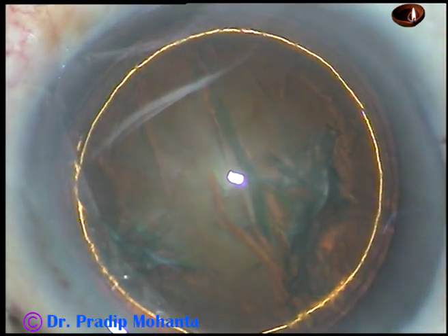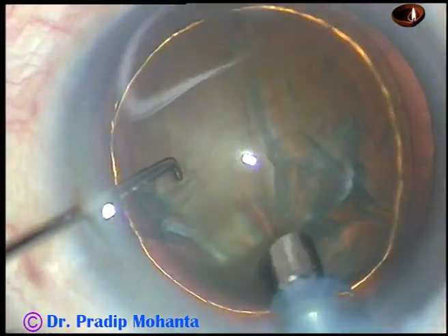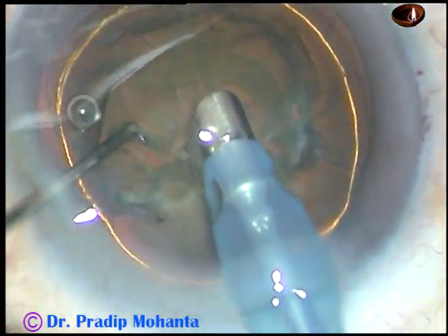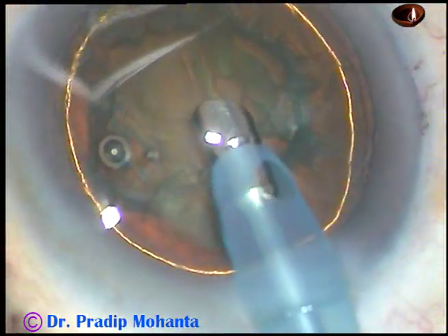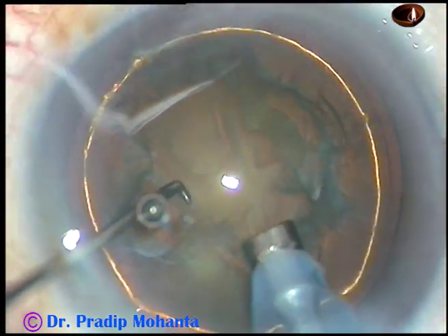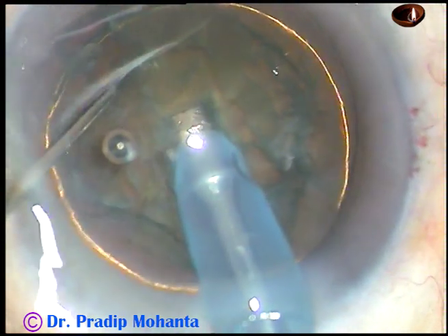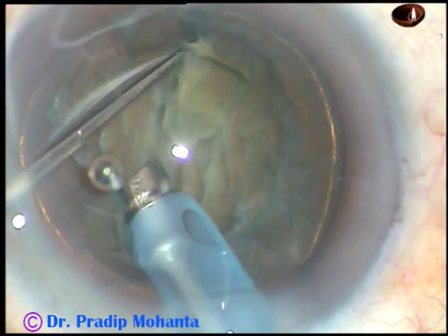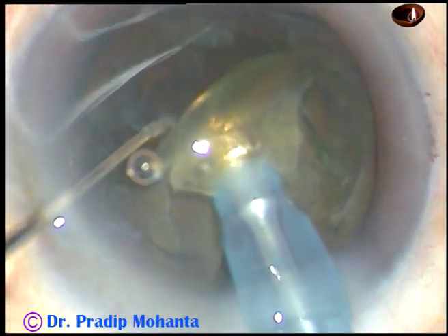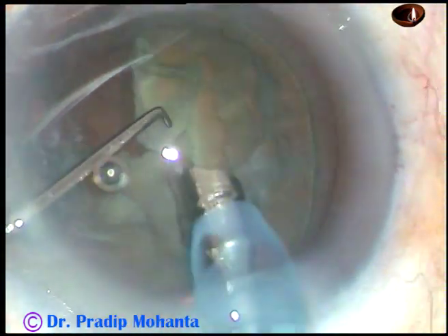And now, since this is a very soft cataract, let us see how we can divide this nucleus into several parts. Here it is — go bevel down, remove some superficial cortical lens matter, turn the handpiece, make it bevel up. Now bury the tip just in front of the main incision. In soft cataracts, using irrigation with very minimal vacuum, use the chopper to cut the nucleus into several parts.